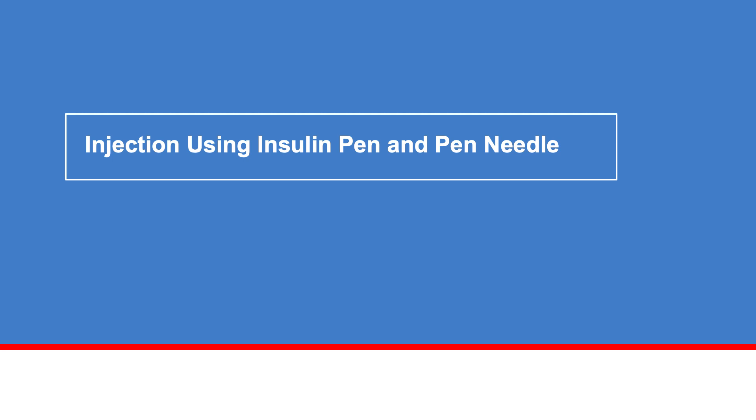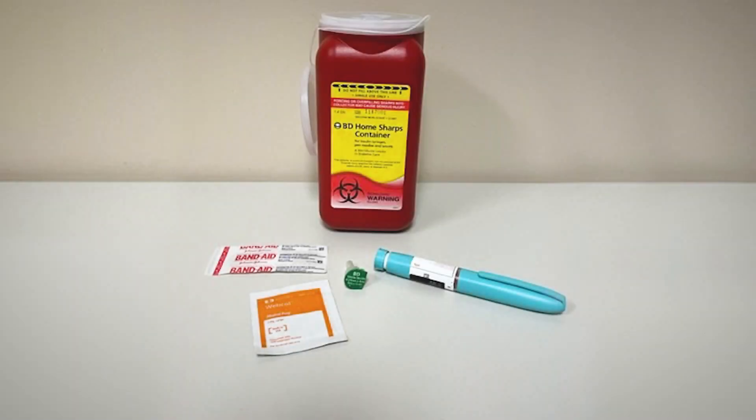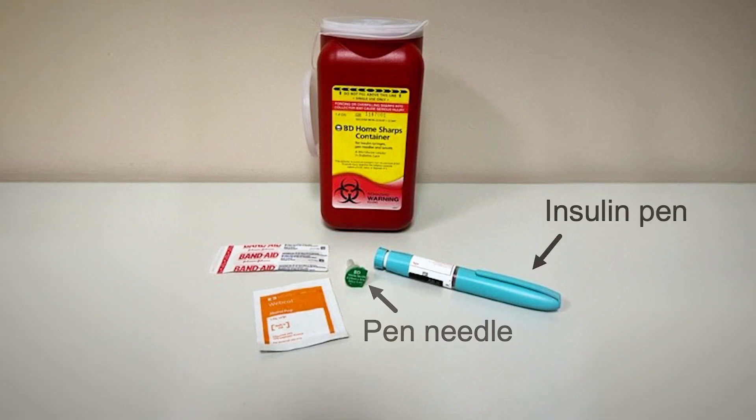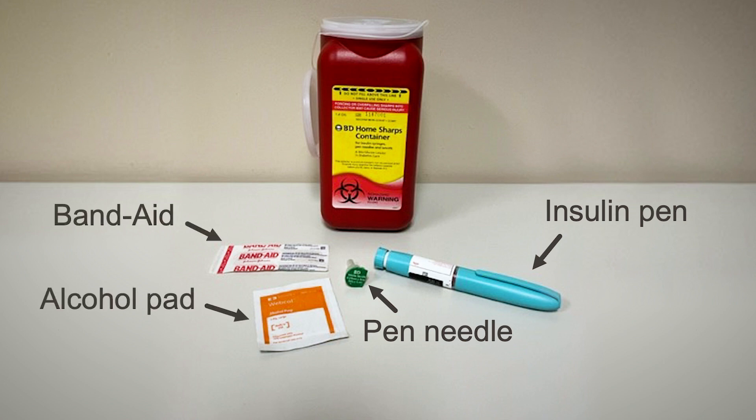Now you will learn how to inject insulin using an insulin pen and pen needle. Start by gathering your supplies. You will need the following: an insulin pen, a pen needle, an alcohol pad, a Band-Aid, and optionally a sharps container to throw away used needles and syringes. Remember to never reuse or share insulin pen needles. Always throw them away after each use.